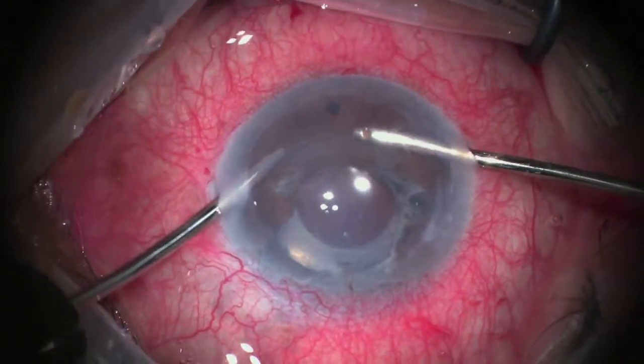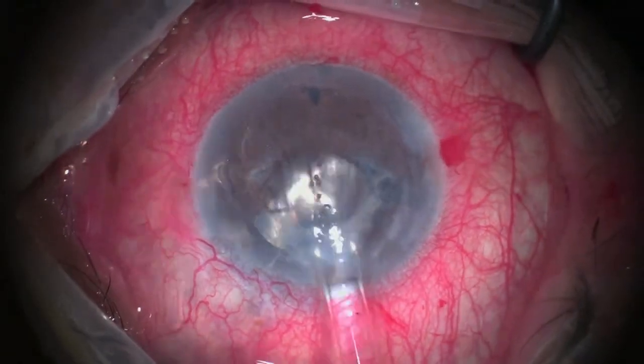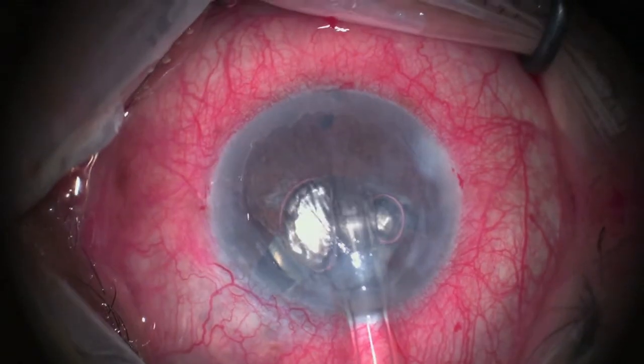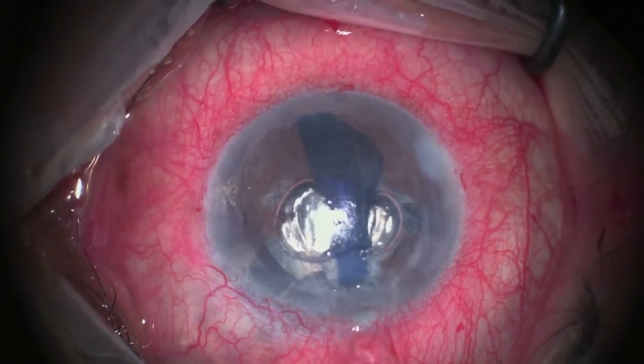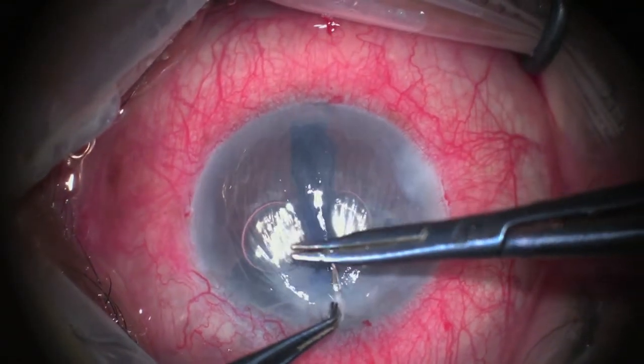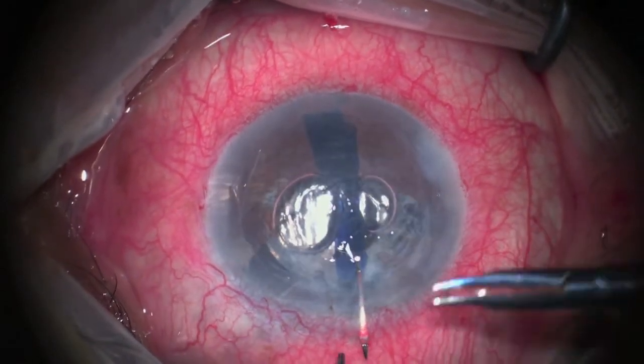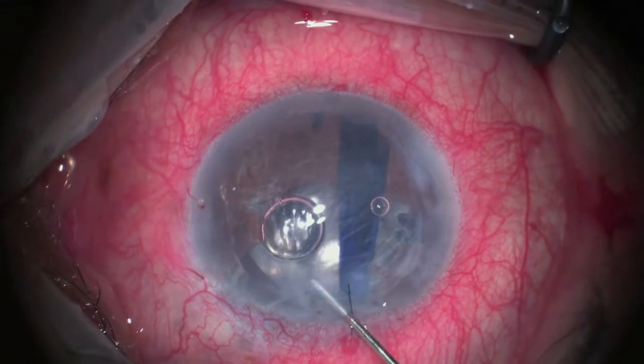Irrigation and aspiration of the viscoelastic is done. This is followed by injection of the DMEK graft. We note here there are two air bubbles that have been introduced during injection. This should be avoided as it may interfere with the desired position of the graft.